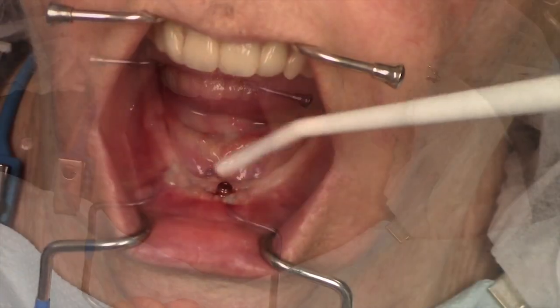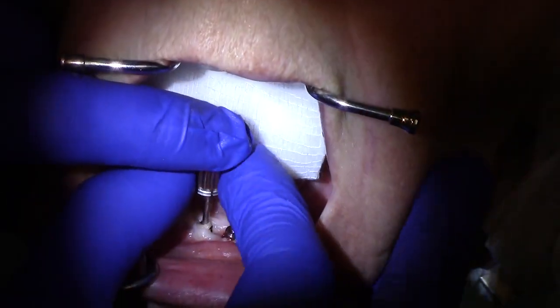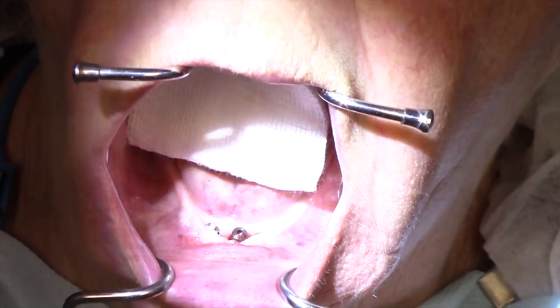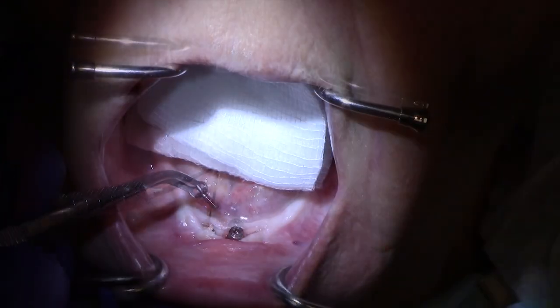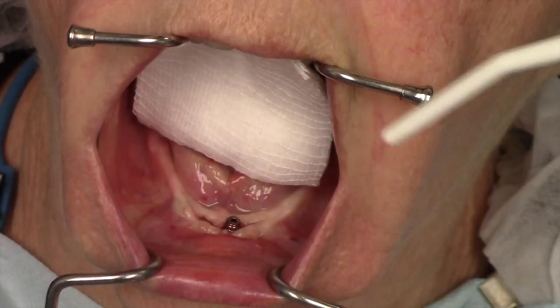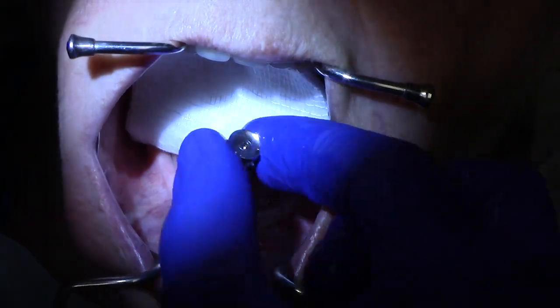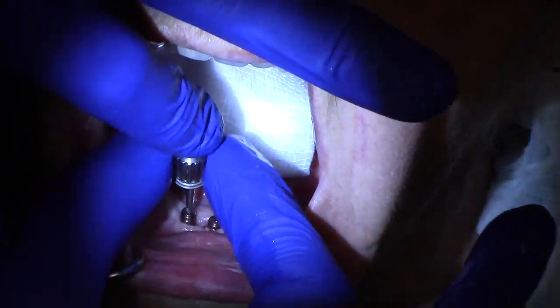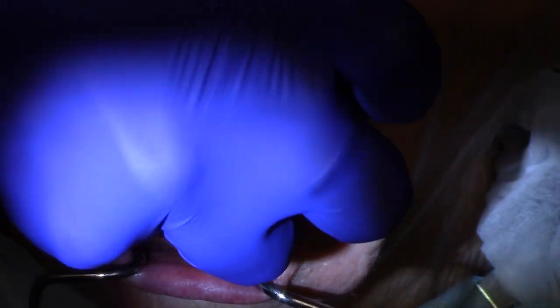The next series of abutments was also easily removed using the 0.050 inch hex driver. The patient had four implants placed; the anterior two were exposed just during the healing process. Taking a periodontal instrument and irrigation, and placing the locator RTX abutment that corresponds with the soft tissue height measured with the periodontal probe, the abutments were finger tightened until completely adapted to the implants.